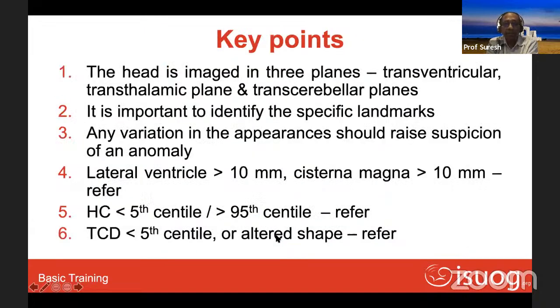So the key points are the head is imaged in three planes: transventricular, transthalamic, and transcerebellar planes. It's important to identify the specific landmarks. Any variation in the appearances should raise suspicion of an anomaly.